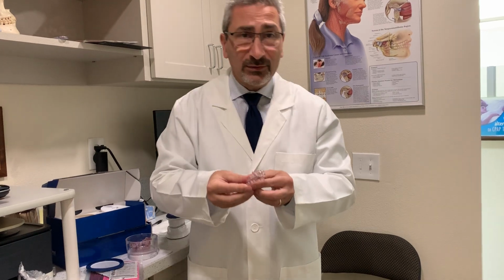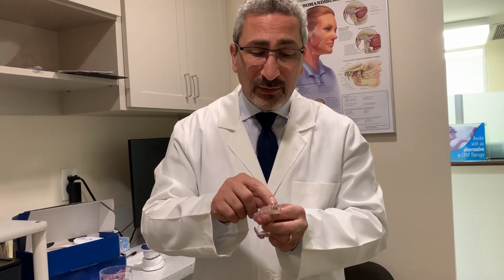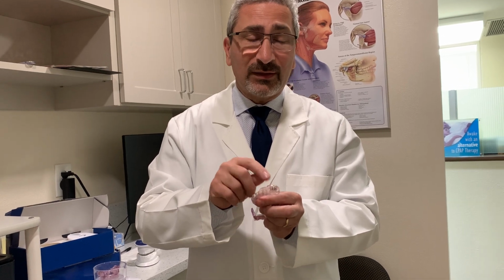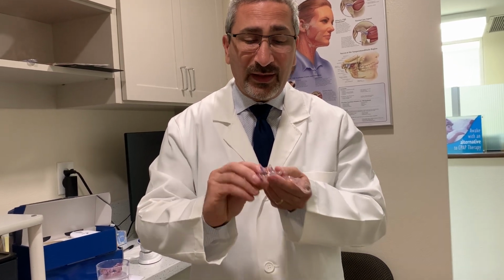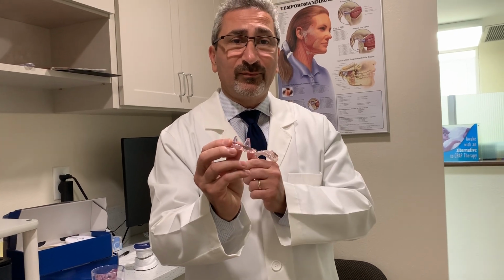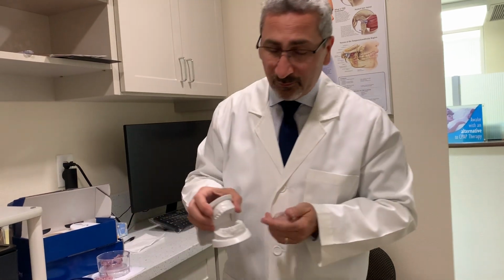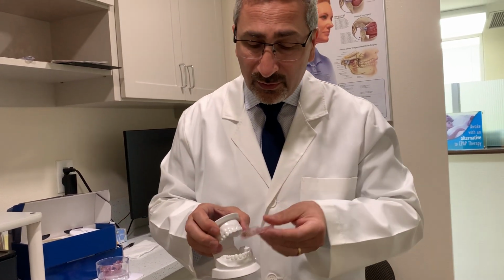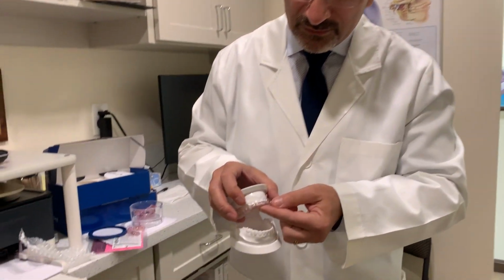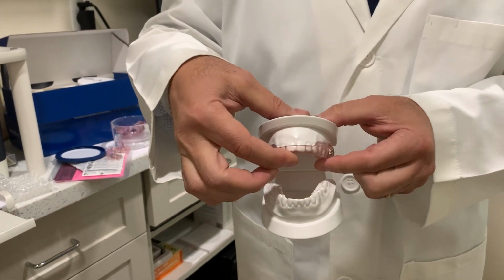So the mouthpiece is going to look something like this. It'll be 2 parts. The upper will have an orthodontic expander. The lower has these 2 little wings that are adjustable. So when you put in the mouthpiece, I'm going to take my model here. When you put it in, always put in the upper front teeth first and then push the back into place.